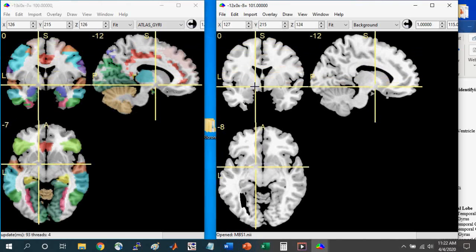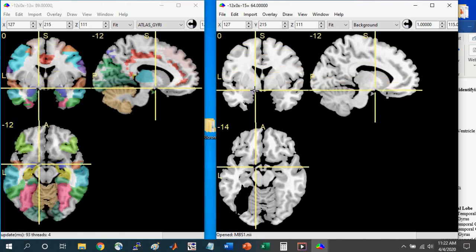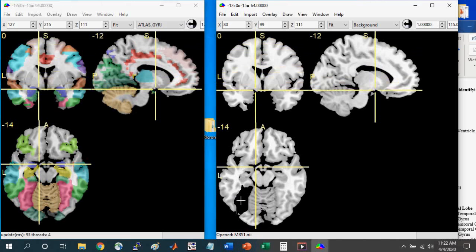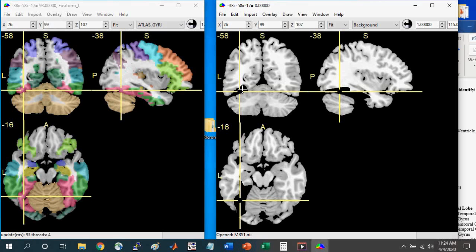As I'm scrolling down, I see here that something is missing. So I can left click on here, and if I study, then I can identify this as the fusiform. If I'm still learning and want to use these resources, I can look on the gyri brain and see that it's labeled the left fusiform. And so this exercise is good for testing brain navigation and testing whether you can determine if the parts of the brain are all intact and whether you can determine what's normal and what's not in a brain file. It's also great for learning neuroanatomy.